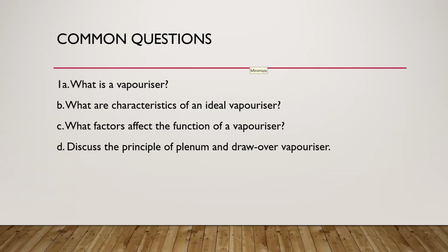What is a rotameter? What factors cause inaccuracy of rotameter readings? Altitude. Rotameters are constant pressure variable orifice flow meters. Okay, beautiful. So what are the things that can cause inaccuracy?